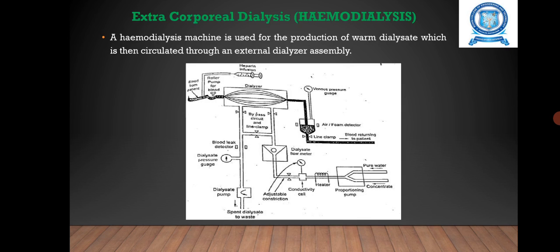If you are using the fixed ratio type, the ratio of concentrate and water is determined by the ratio of two pump piston diameters. These are mechanically fixed at a ratio of 34:1. If you are using the variable ratio type, a variation of plus or minus 5% on the standard dilution ratio of 34:1 is possible. And then the flow meter is measured using a flow through transducer which produces a precise number of pulses per minute.